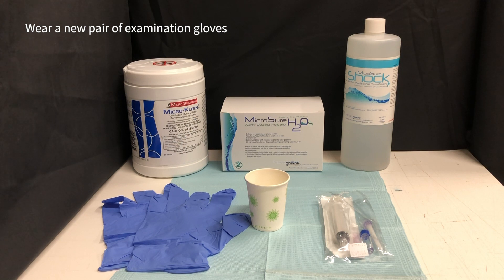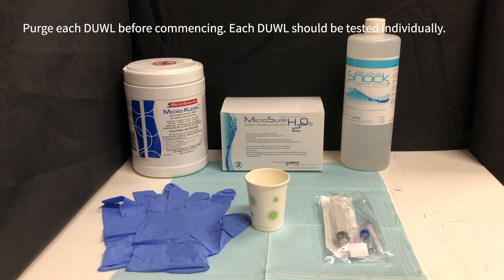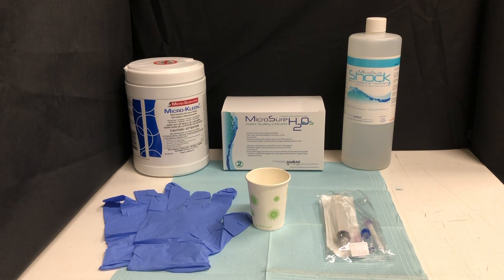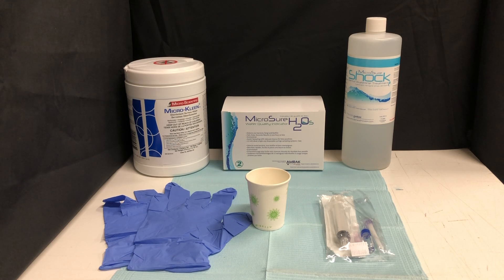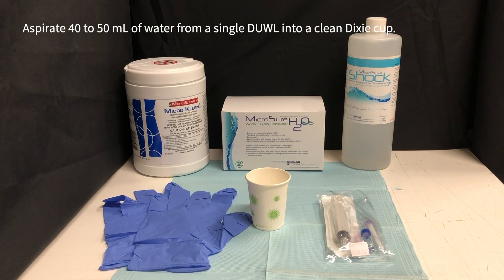Wear a new pair of examination gloves. Purge each DUWL before commencing the test; each DUWL should be tested individually. Lay out a clean tray cover in your work area and aspirate 40 to 50 milliliters of water from a single DUWL into a clean Dixie cup.